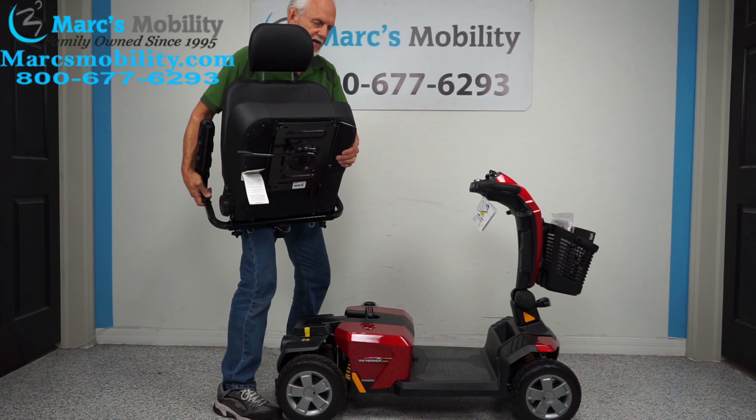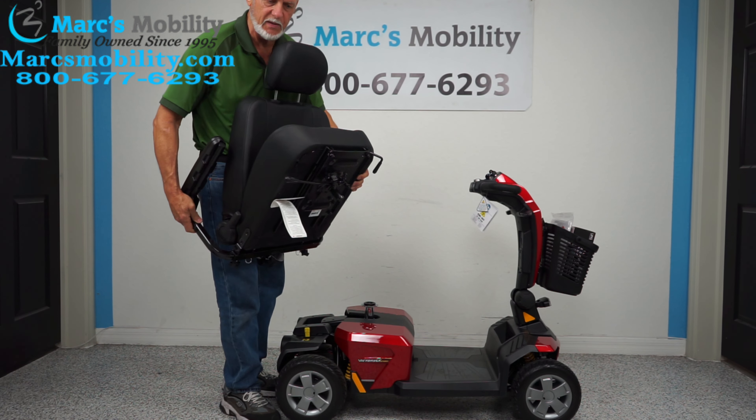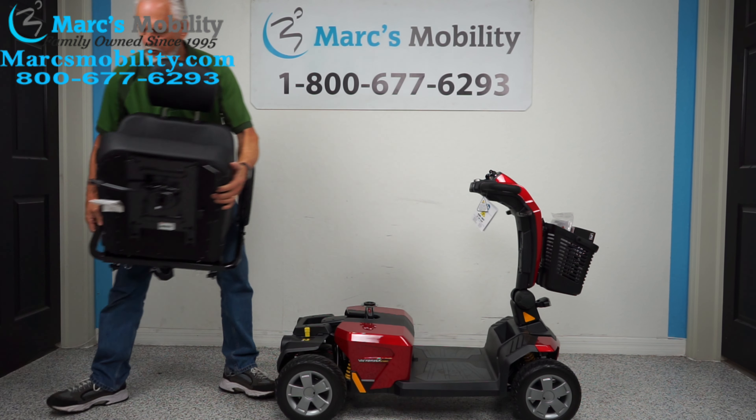You can see it's a heavy seat — it's about a 30-40 pound seat — so sometimes if you have two people and you pull straight up, it'll come right off.